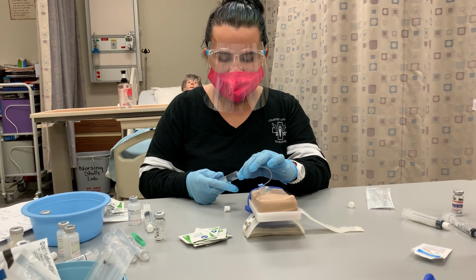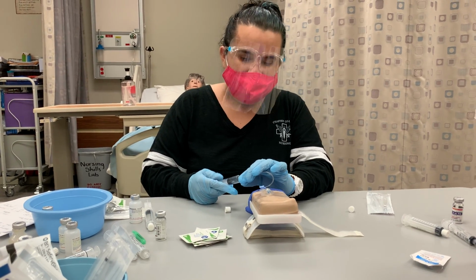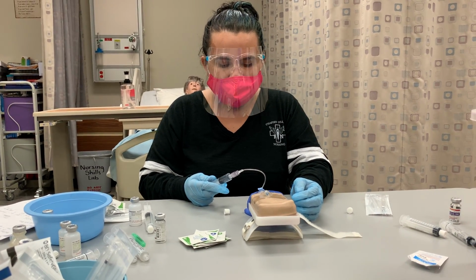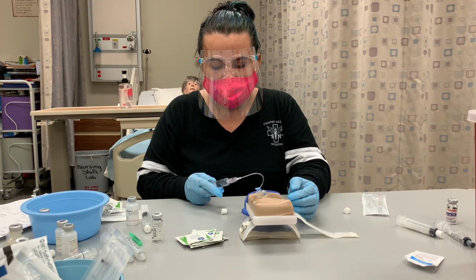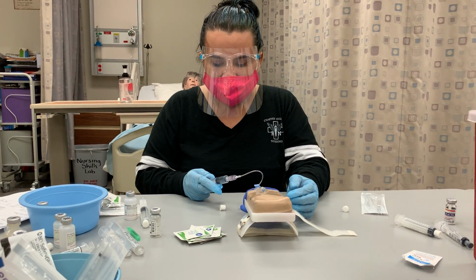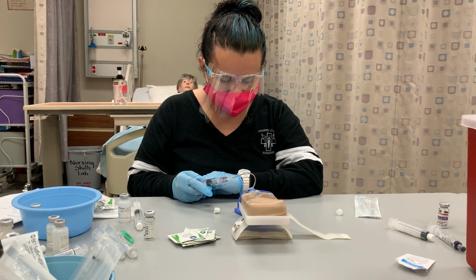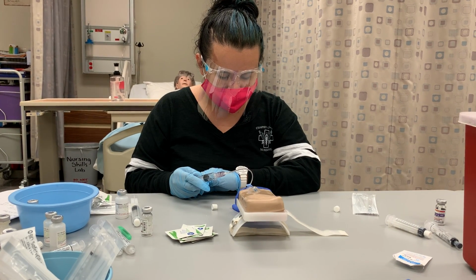And we agreed that every 30 seconds we're going to be giving 0.75 mLs. I'm sorry, 0.75 mLs per 30 seconds. So I am going to be doing this slowly enough, 0.75, where I do my medication for 4 minutes. Explain the procedure to him and let him know that I'm going to do it.